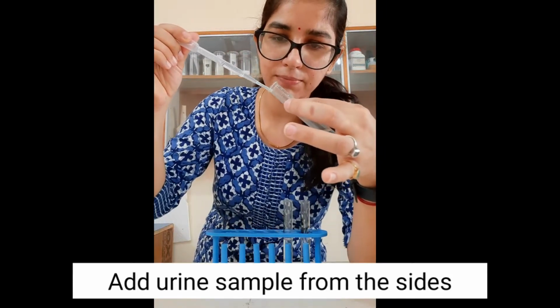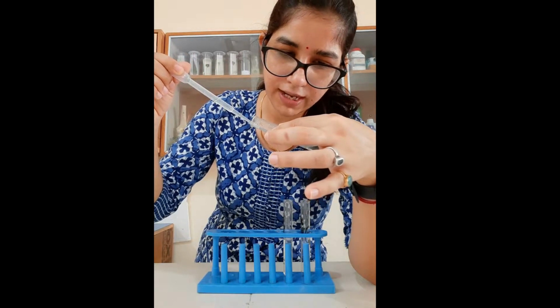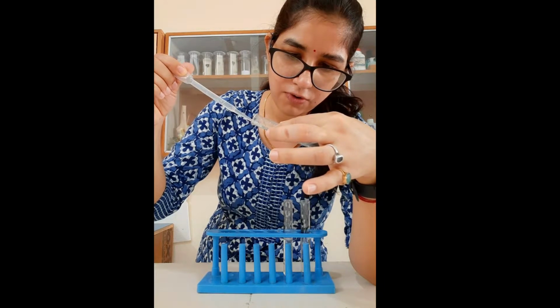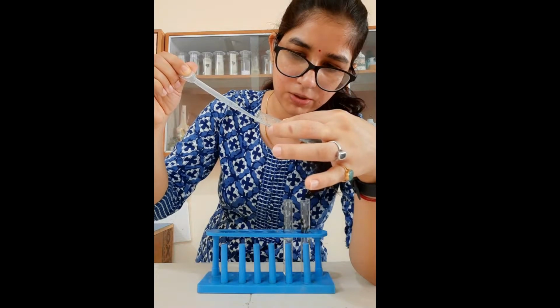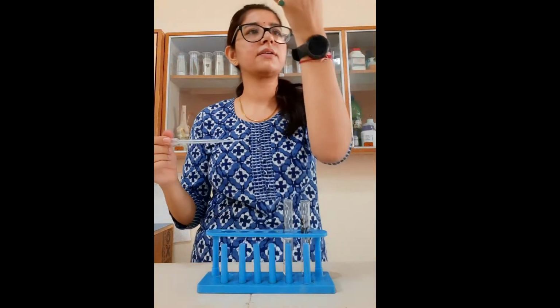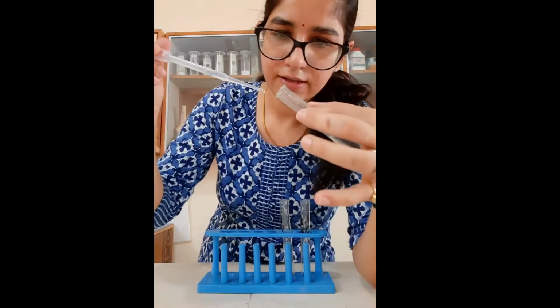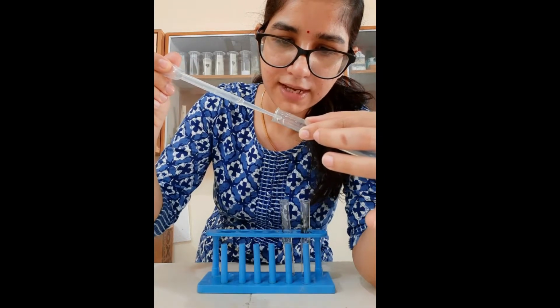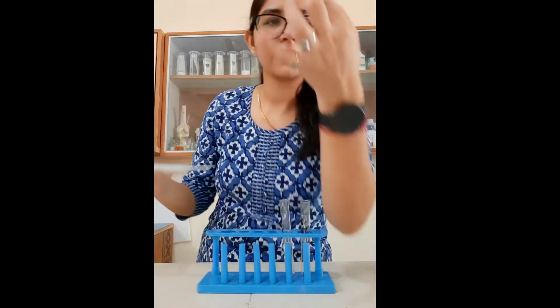and we have to pour our urine sample from the sides of the test tube, so that it forms a layer over the nitric acid, right? So I will add my sample. As you can see, I am adding it from the sides of the test tube, right?